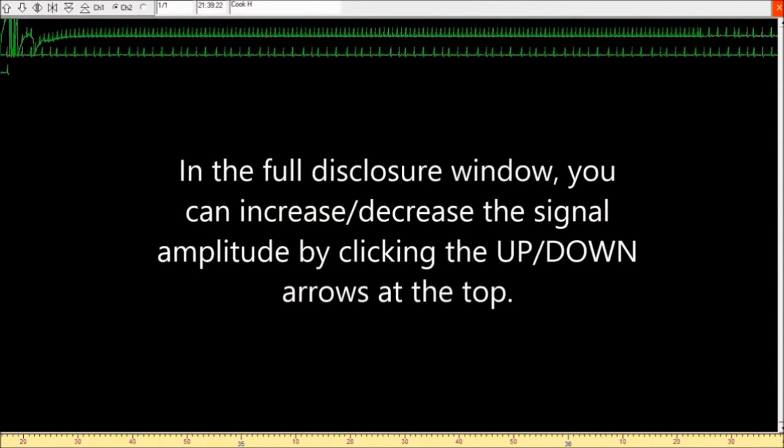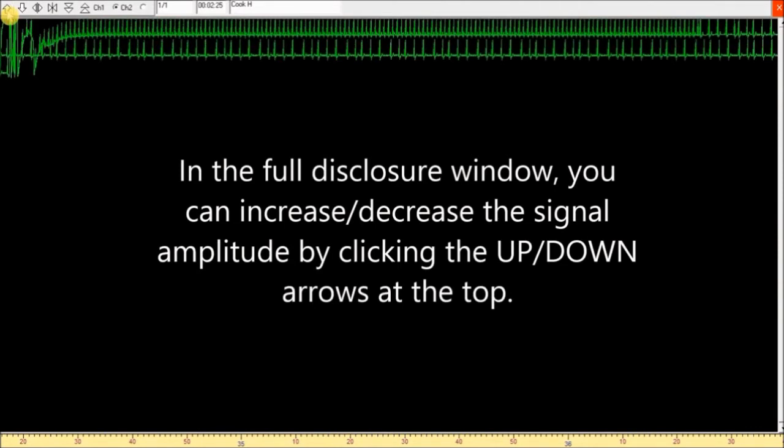In the full disclosure window, you can increase or decrease the signal amplitude by clicking the up-down arrows at the top.